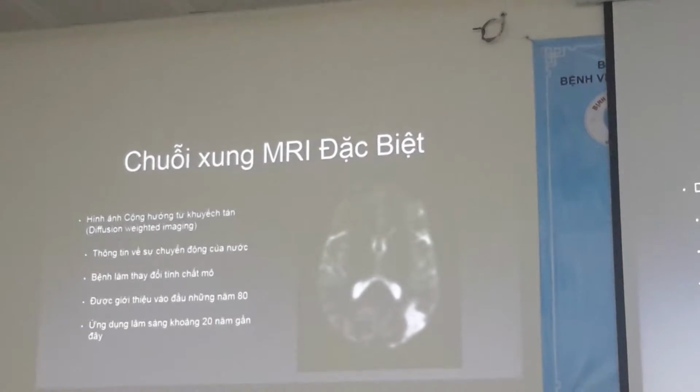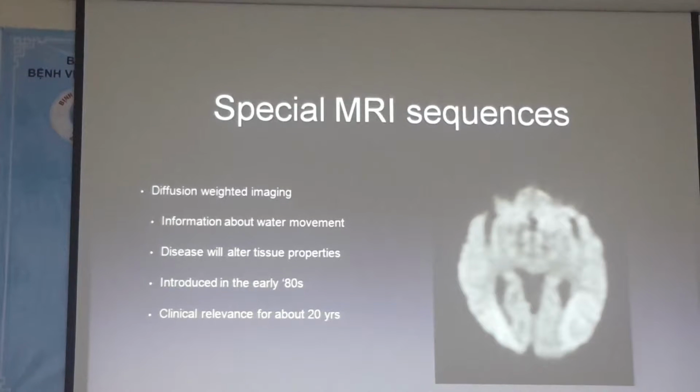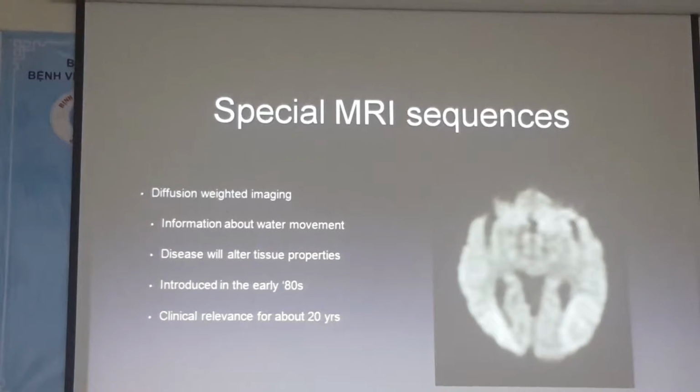Evidence of optic nerve ischemia if you see abnormal DWI signal within the optic nerve, but that is fairly uncommon.